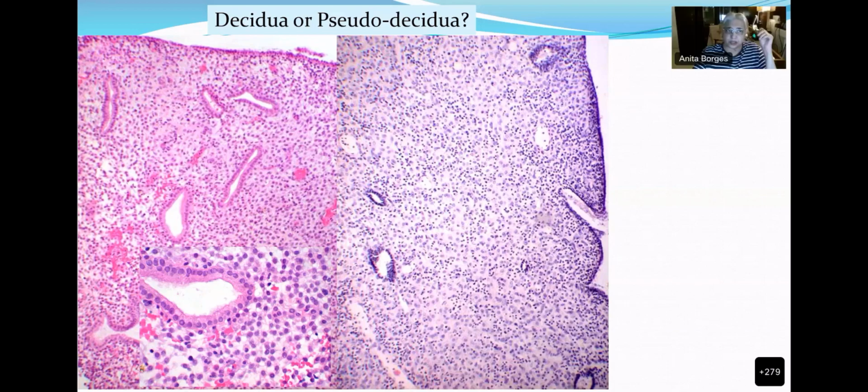Sorry, what happens in decidualization? You can see I have a view over here. Yes, it is decidua. So what is decidualization? All right, anybody else? Increase in the glycogen content of the cells. Of what? Stromal cells. Stromal cells. You think that if you stain this with PAS, it would stain brightly and then it would be digested? Oh, you think that there is glycogen that is collected over there?